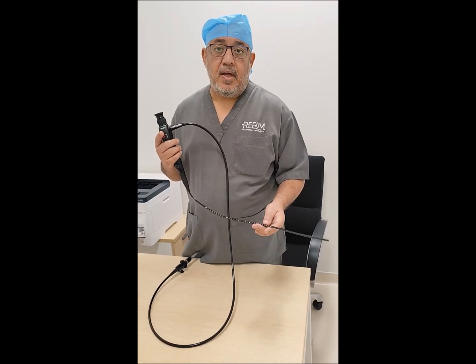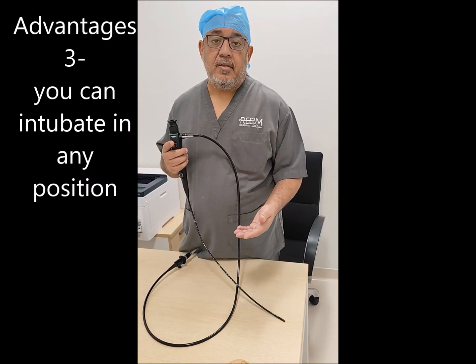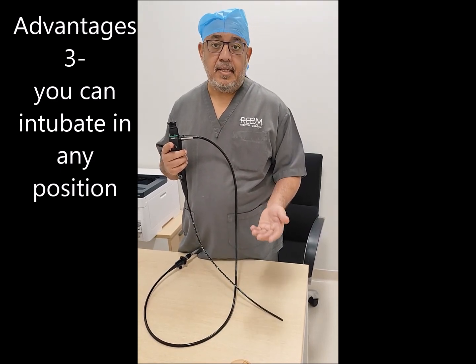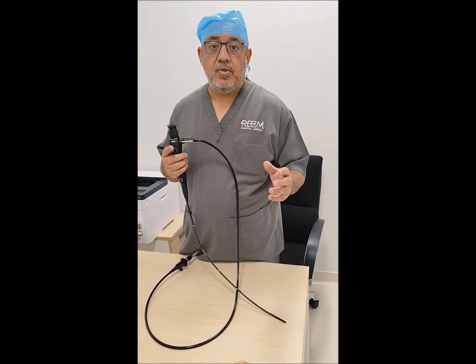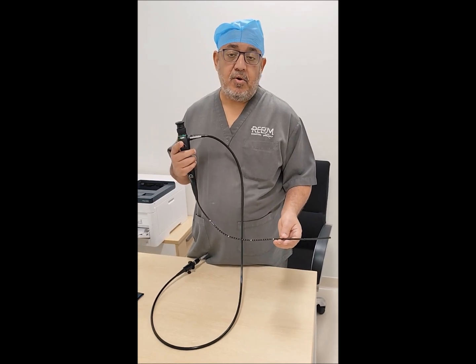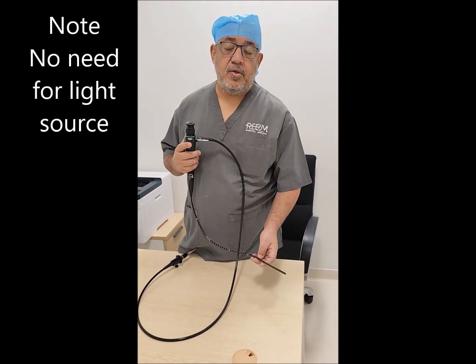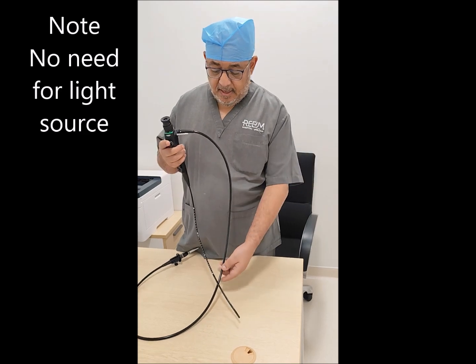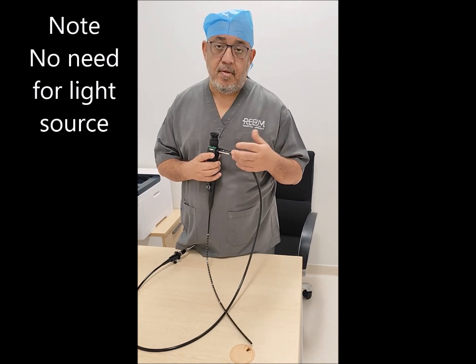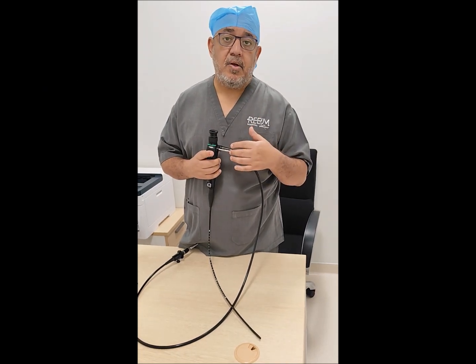Another advantage of adding the fiber optic to the video laryngoscope is that you can perform intubation in different positions — not only supine, but also lateral and prone positions. In cases where you have to intubate in such positions, this combination will help you significantly. The assistant looks at the screen of the video laryngoscope camera, so the fiber optic light source attachment is not needed. You can also connect suction if you find secretions after exposing the larynx, or you can replace it with oxygen.